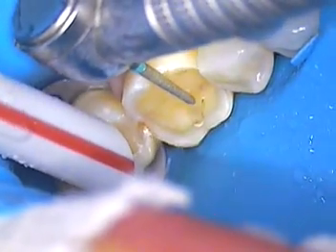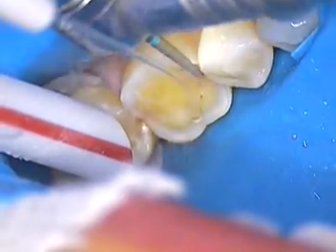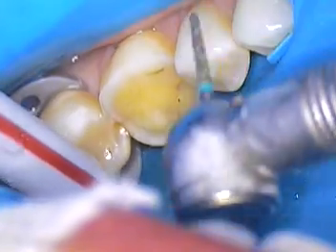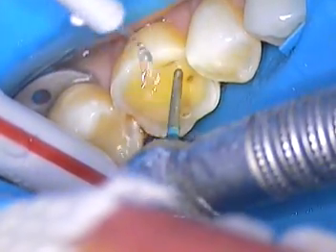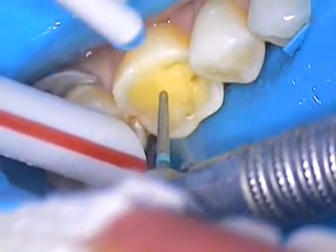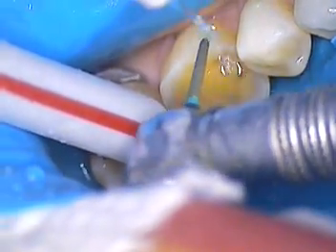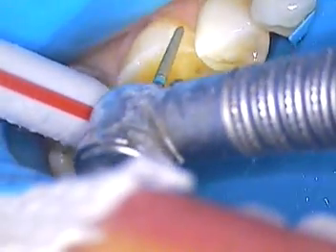I'm going to do my V-cuts into the tooth — you've got a central groove, which amounts to a central groove, and then the laboratory can follow this and trace out the anatomy. There's still composite that we have to remove. I can see a little spot right there, and some composite. There's composite still there beyond the normal preparation outline that has to be removed, so I'm going to continue with my preparation and start to come into the interproximal and develop that.